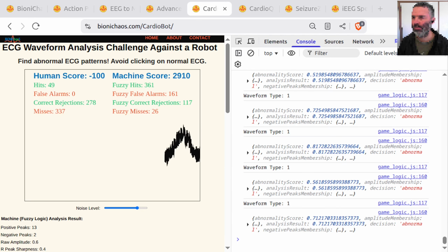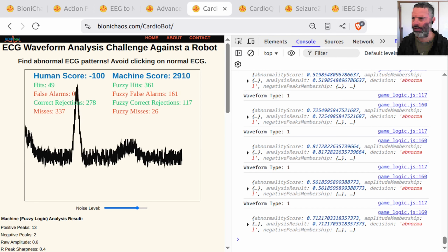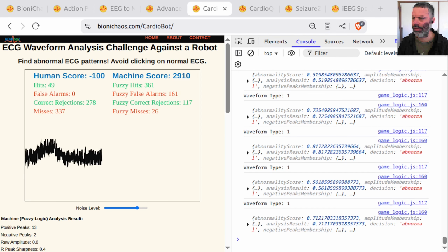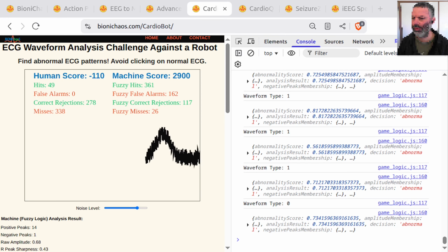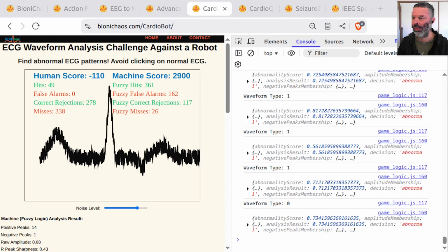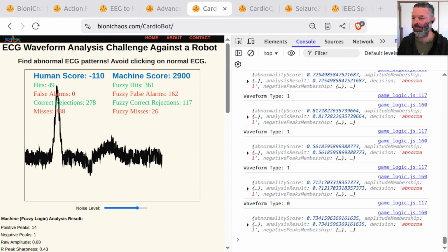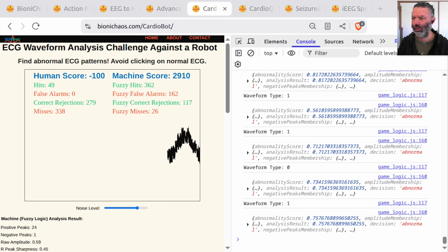It's critical to highlight the move from numerical input to linguistic variables, how a single number becomes a degree of too long or too short. It validates the AI bot's decision-making. The bot isn't guessing, it's weighing the evidence. It's saying the R-peak is 70% wide and 20% normal, so the likelihood of an abnormality is high. It's an honest AI that admits its uncertainties.